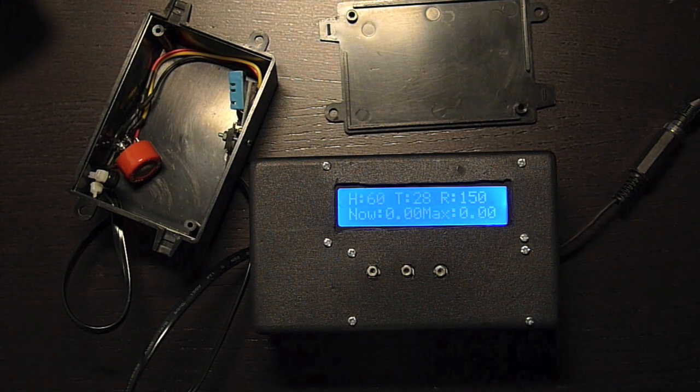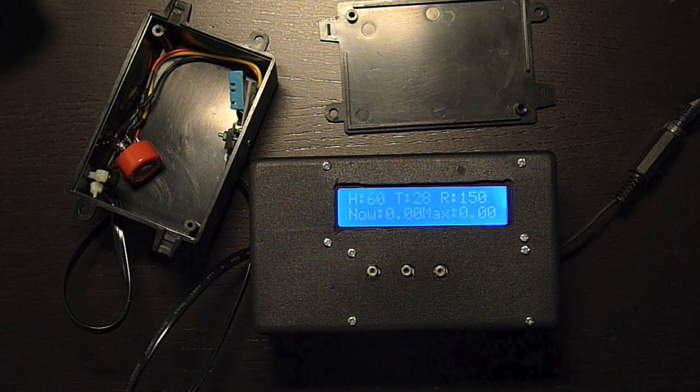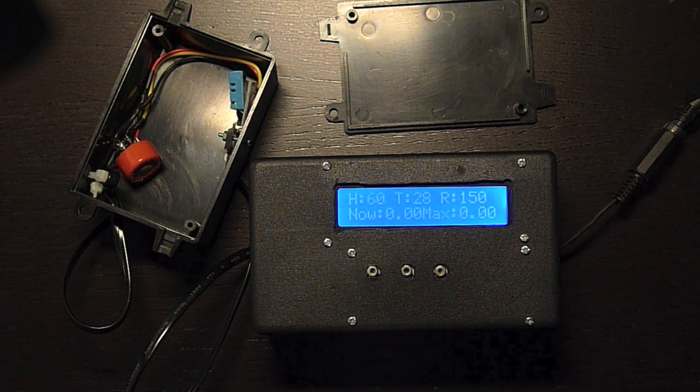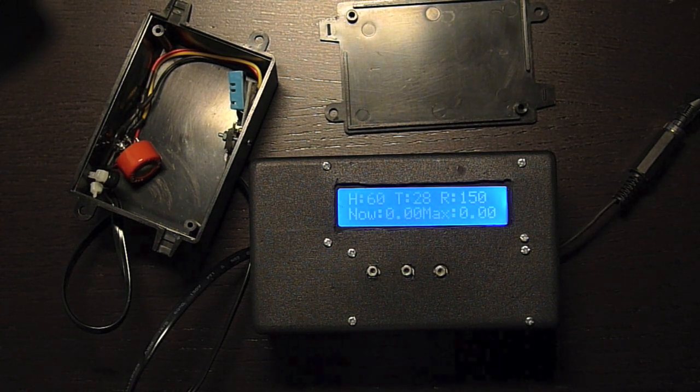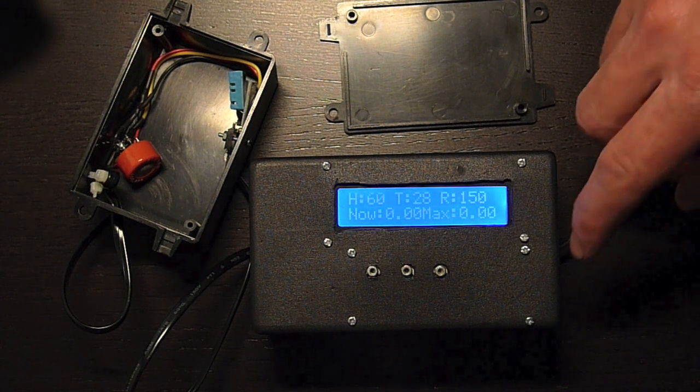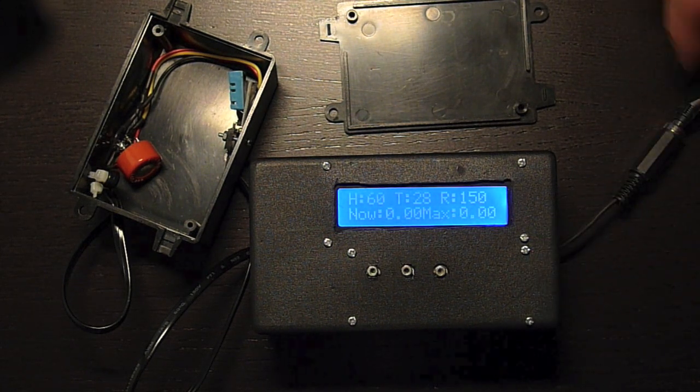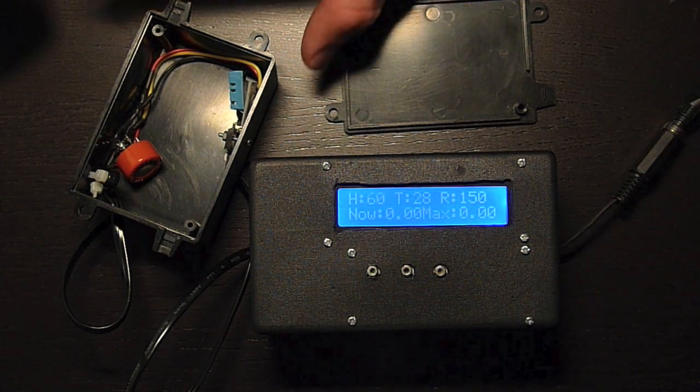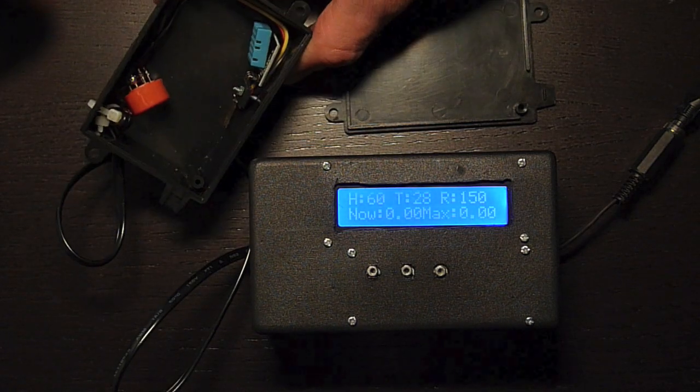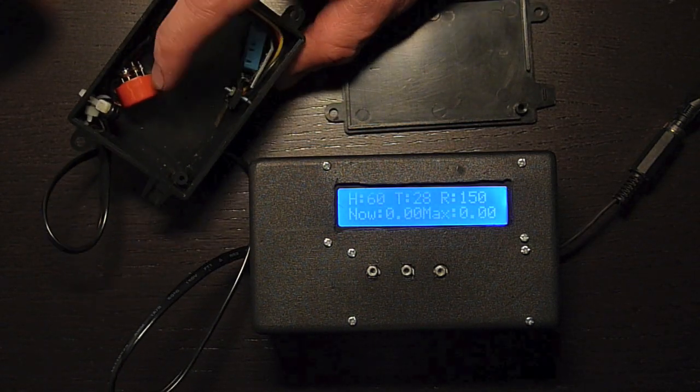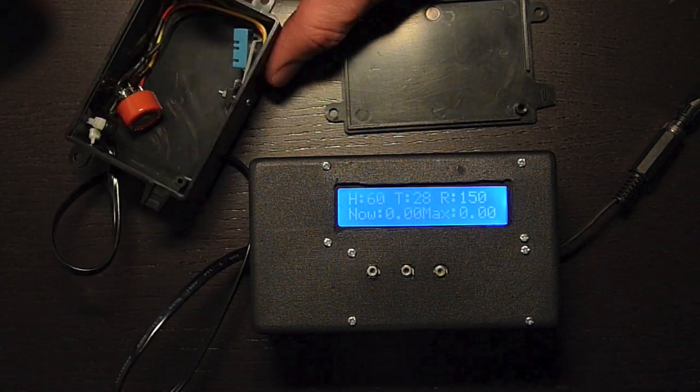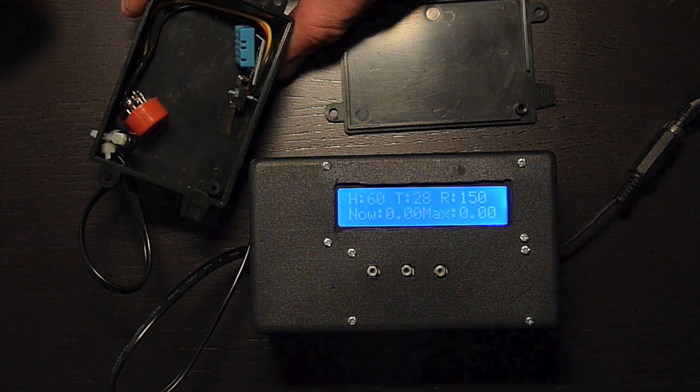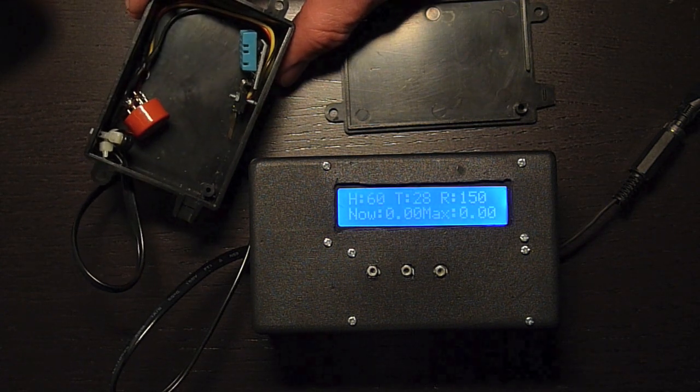It consists of a main unit with the microcontroller inside, an Arduino UNO board, an LCD, and some buttons. And this mouthpiece here which has an electrochemical gas sensor inside and also temperature and humidity sensors.